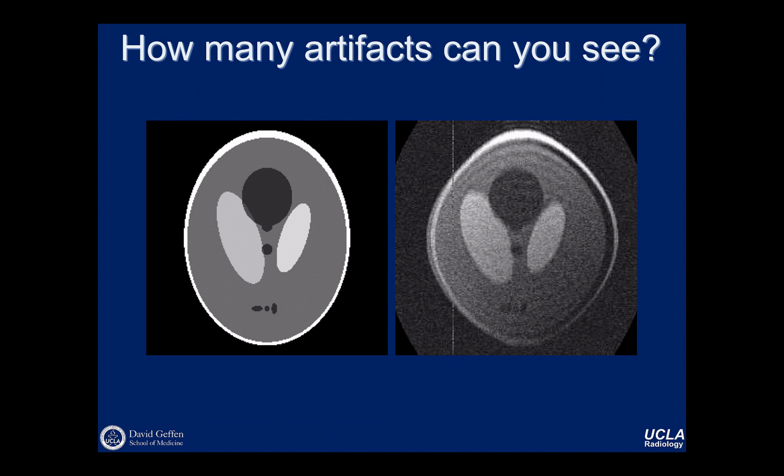On the right, you have black and white canceling out the signal. Are you thinking about this right here? Yeah. So what is that? It can happen because you have 2 signals that are close together. So if we have in phase and out of phase stuff, that's chemical shift type 2. That could happen. In this case, all that's happening is you have this really bright ring.